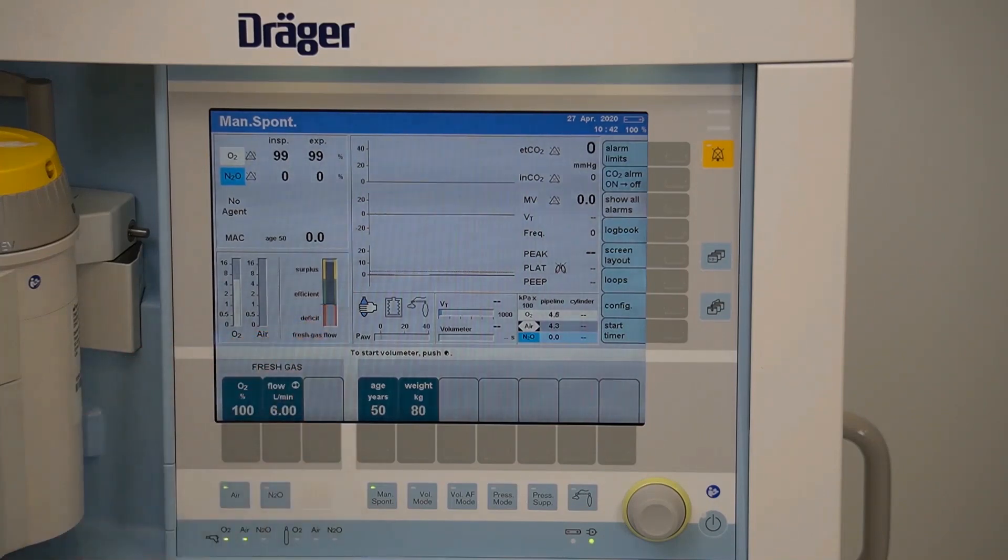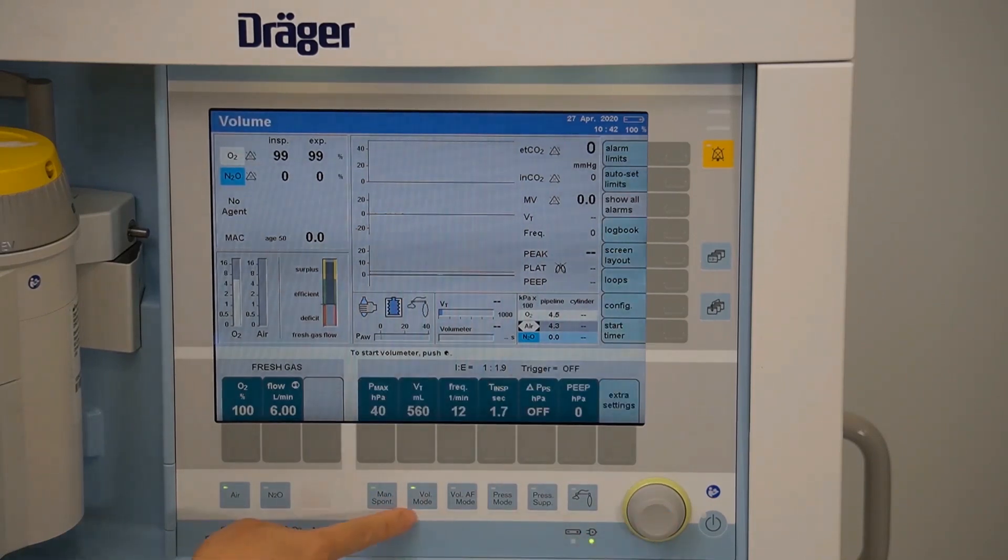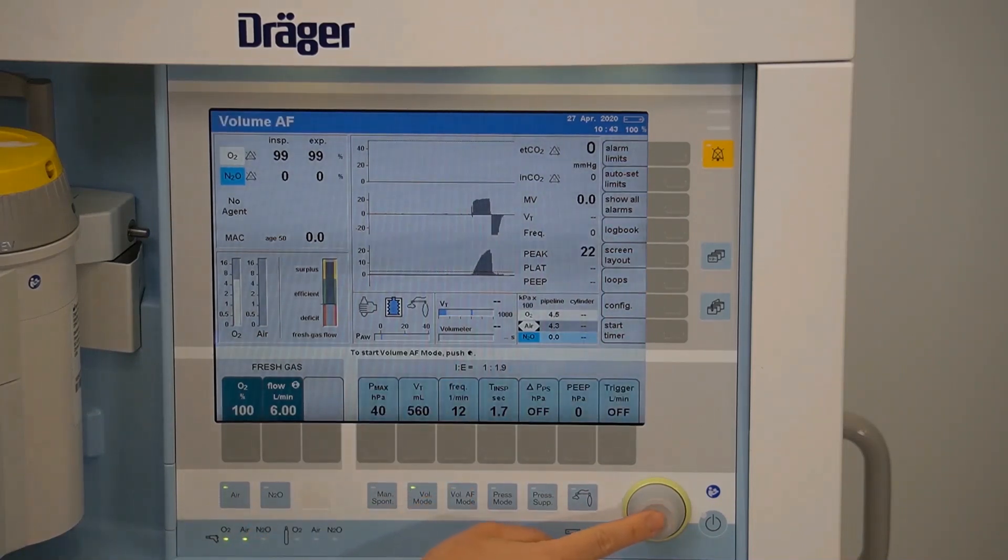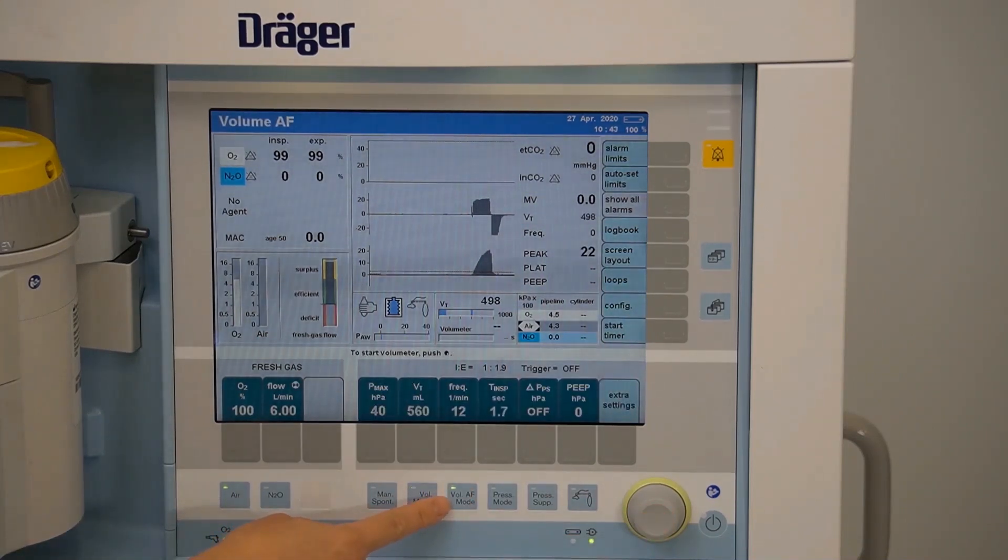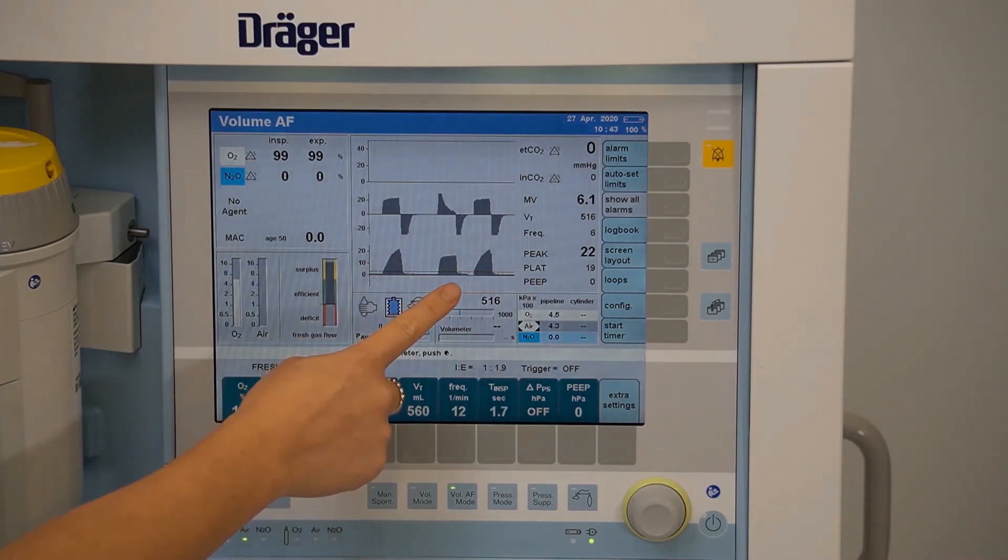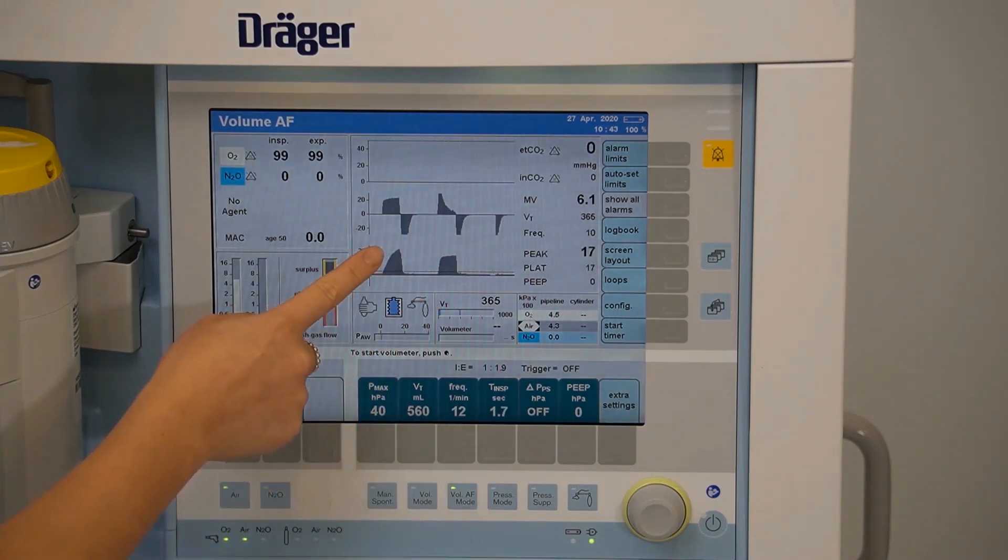Volume mode will allow you to set your target tidal volume. Vol AF mode stands for volume auto flow mode. This will target your set tidal volume but regulate your airway pressure breath by breath. It'll avoid that peak inspiratory pressure and have a more rounded top which indicates lung protective ventilation.